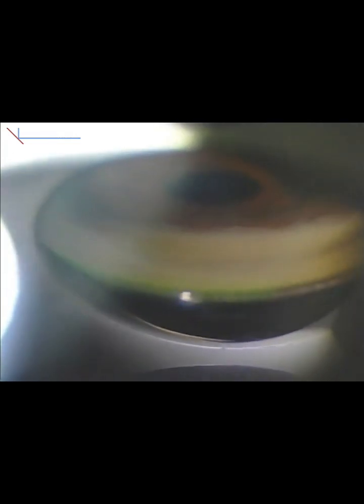This 80-year-old woman who is hyperopic was found to have narrow angles. You can see that the angles are quite narrow here, but when I indent, she has multiple synechia visible only on indentation. Again, I let up here, synechia disappear, and as I push, one can see several tent-like synechia. As I release the pressure, we develop more obvious apposition. But with indentation, we can see that there's not only apposition, but an intermittent synechia in this particular individual.